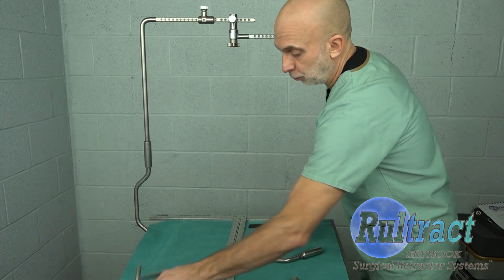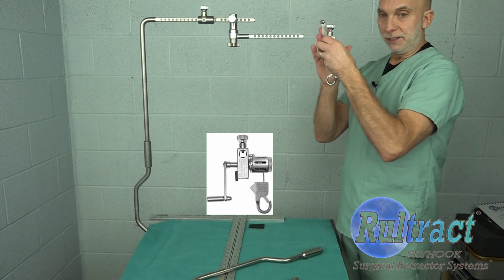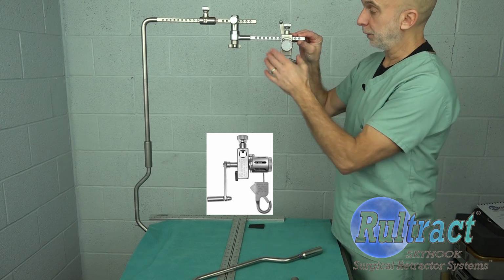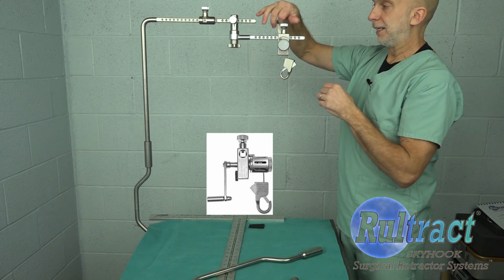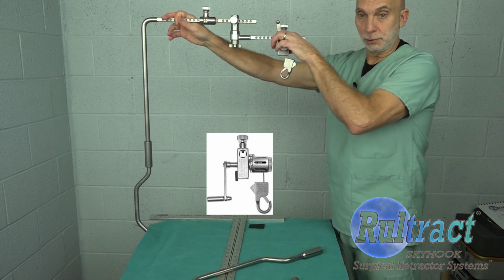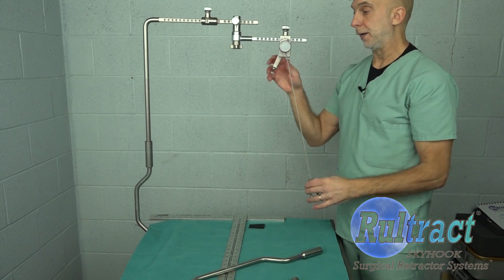Then you would take your Rultract, make sure that the spool and the cable is out over the patient's chest and the handle is out over the patient's head. So you'll put that on, decide where it's best for what you're doing at the time, put it in between the alignment marks, and then tighten it down. Make sure that that's into a detent. You can see here all of this is very secure, so go ahead and check it and make sure of that. And then you're going to lower your retractor and attach it to the Thoratrak.